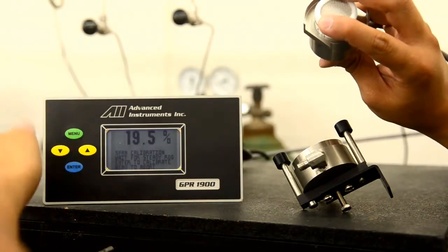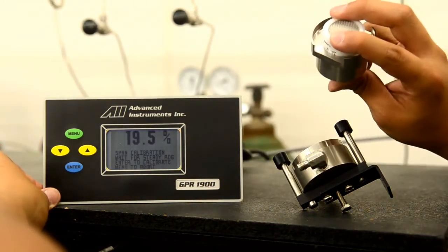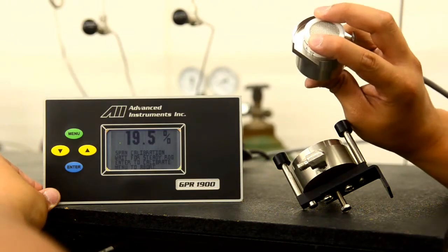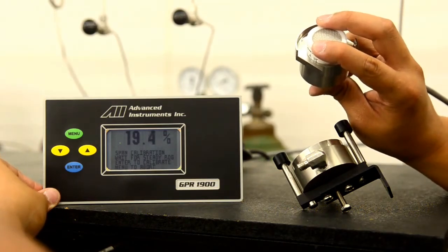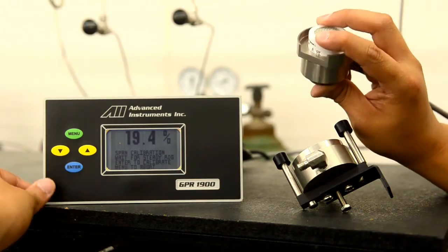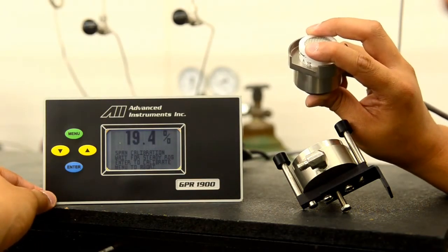As you can see here, the sensor is responding to ambient air. We want to firmly hold the sensor in place for a few minutes to ensure that the reading is stable. Once the reading has stabilized, say 19.4%, we are ready to hit enter to calibrate the sensor.